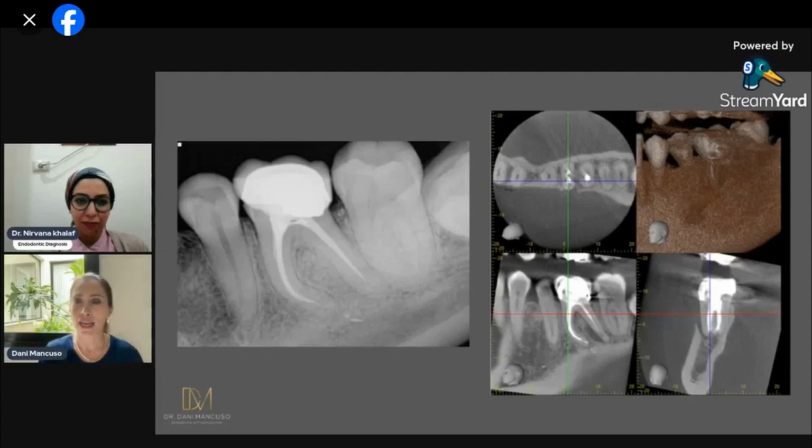And I took the scan and I saw the radiolucency, like a loss of buccal bone, not as much apical radiolucency on the mesial root, periradicular radiolucency on the distal though, but not on the mesial. On the mesial, there was loss of the cortical bone cervically and mid-third. Why couldn't I probe that tooth? Perhaps a long epithelium or something like that, but I was a bit puzzled because I truly believed this tooth was cracked. And she said to me, can you do something else?